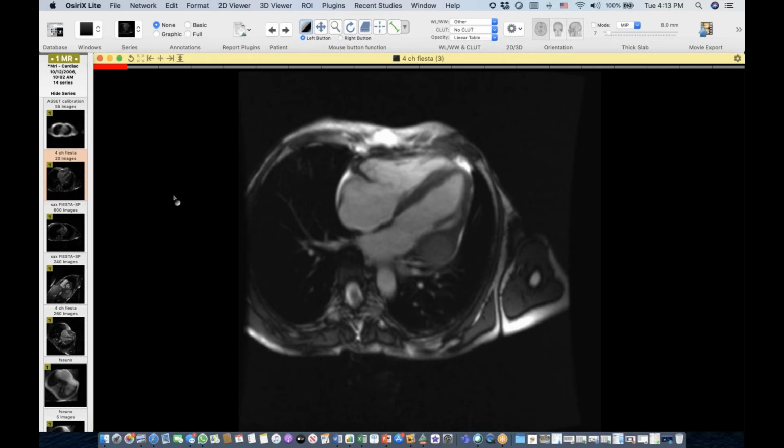Yeah, actually, I had a patient last week who was ordered for a CT chest, abdomen, pelvis, and had a history of a prior myxoid sarcoma resected from the left ventricle. I know this is crazy. They were going to get an echo to look at the heart in a kind of limited view, and then do an ungated CT of the chest. So we did a gated CTA of the chest and a standard abdomen pelvis. And it turns out I was able to measure his ejection fraction. It had gradually dropped from 60 to 30%. He was a young guy who was on doxorubicin. So they canceled his last dose, and they would never have known, actually, because his next echo wasn't scheduled for 2 more months. So we can have a huge role in impacting these patients.